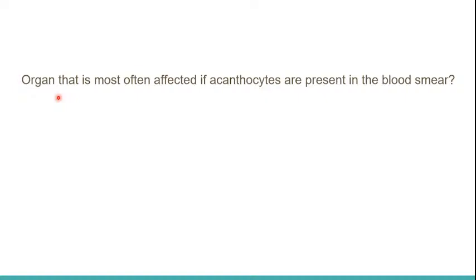Alcoholism. When you look at the literature, acanthocytes are always associated with liver diseases. Neonatal jaundice is another reason why we see acanthocytes in a baby's blood smear if that patient has jaundice.